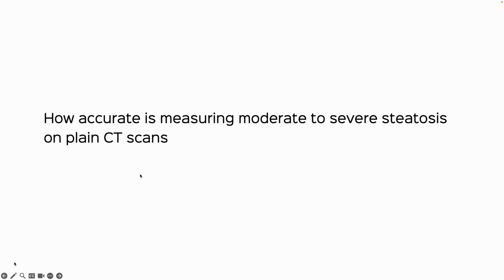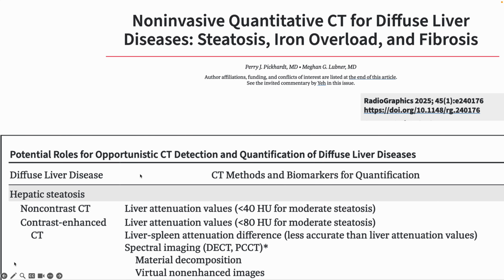So the question then is, how accurate is this? If you have access, there is the Radiographics 2025 article. Of course, if you know me, you can just email me or ask me and I'll send you all these papers. That's not a big deal at all.